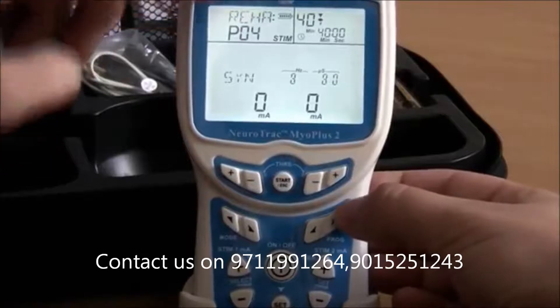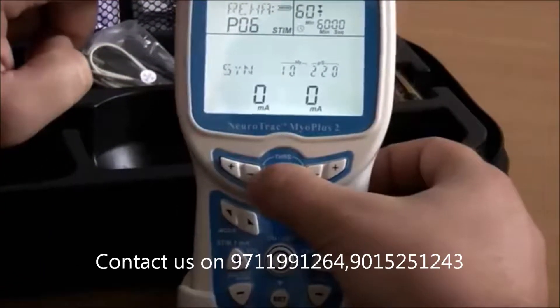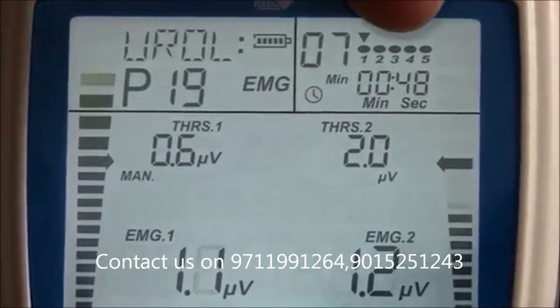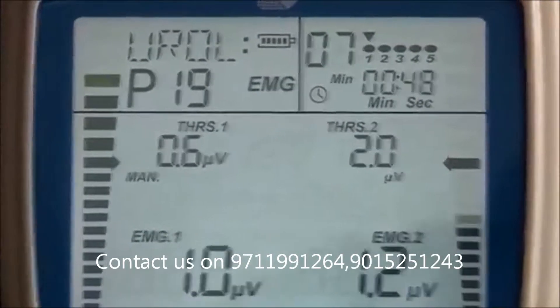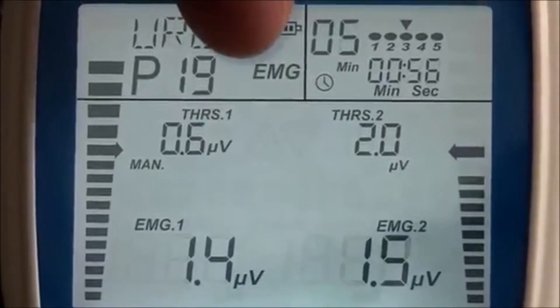By pressing the Program button, you choose which program to use. For example, Urol 19. This is a preset program named Weak Pelvic Muscle. It has five preset phases. By pressing the Set button, you can see the parameters of each time phase of the program, Urol 19.